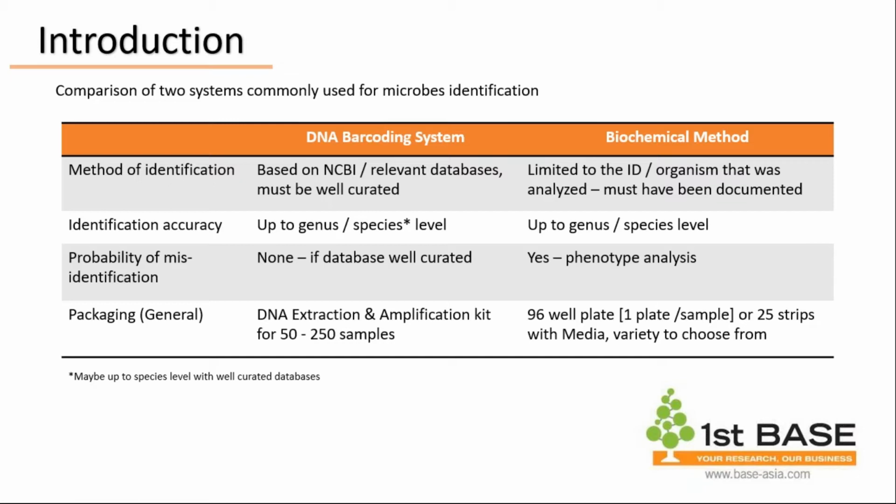For the biochemical method, there is a possibility of misidentification, because the biochemical method depends on the reaction of proteins in the species, and the amount of protein produced can always be affected by the growth environment of the microbe.